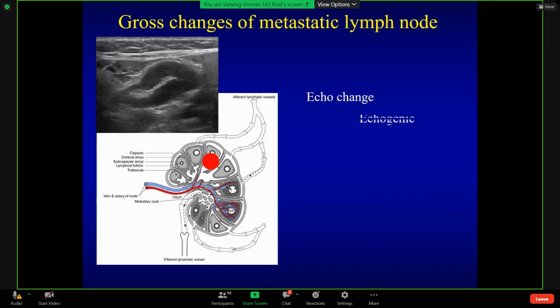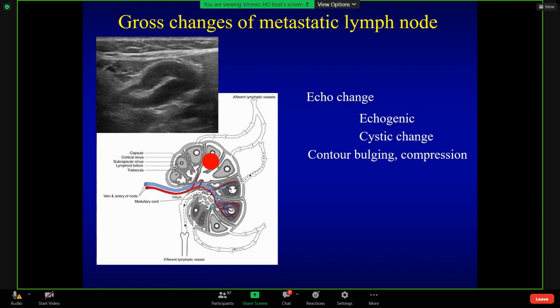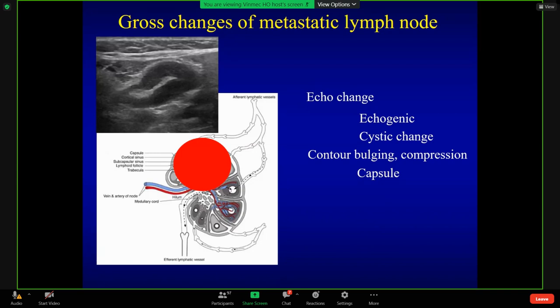First, echogenicity is increased. As I introduced, the cortex echo is low, but metastasis is slightly higher than cortex. The second change is cystic change. Cystic change is induced by bleeding inside the tumor. The next one is contour bulging — when the tumor grows like this, you can see the contour bulging of the capsule, like this.